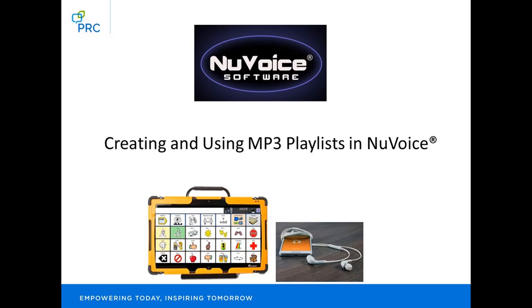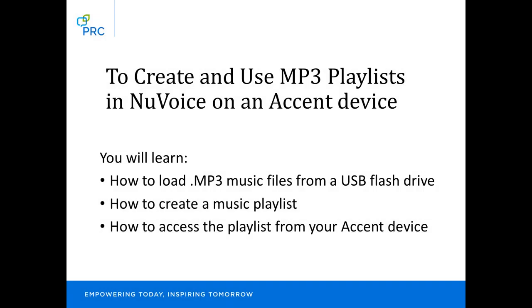In this video, you will learn about creating and using MP3 playlists in NuVoice on your Accent speech generating device. You will learn how to load MP3 music files from a USB flash drive, how to create a music playlist, and how to access the playlist from your Accent device.